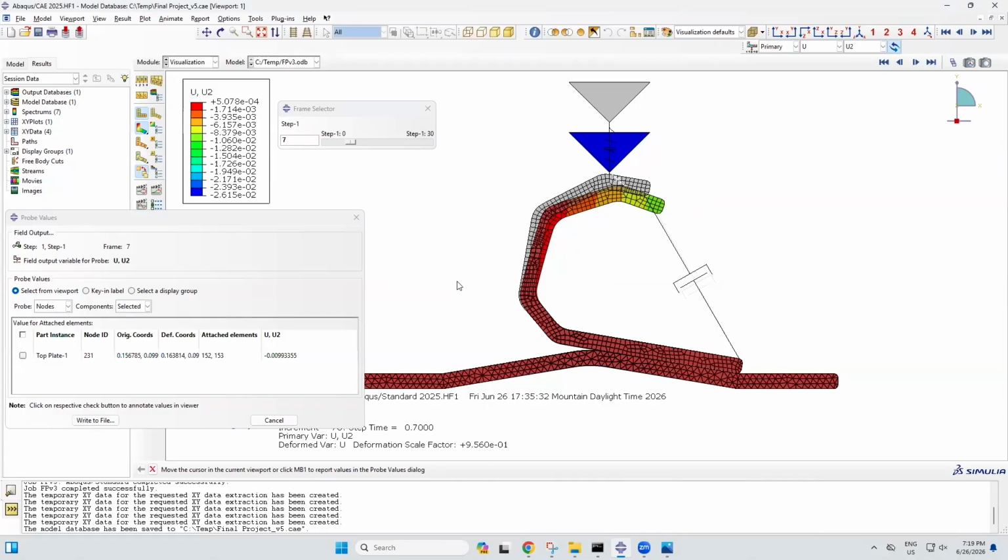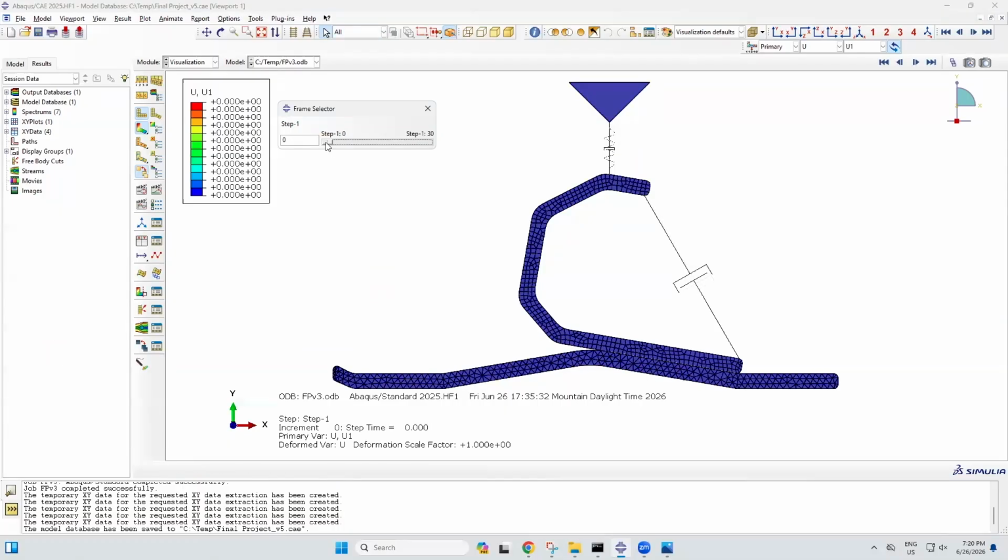Finally, confirming that we are at equilibrium, there is approximately 1 centimeter of downward displacement in step 7, with a resulting horizontal displacement of 7 millimeters to the right. To go over the basic animation, we can see step 0, or no deformation, no load applied. Then we can see step 1, step 2, step 3, 4, 5, 6, 7, and beyond where it doesn't move.